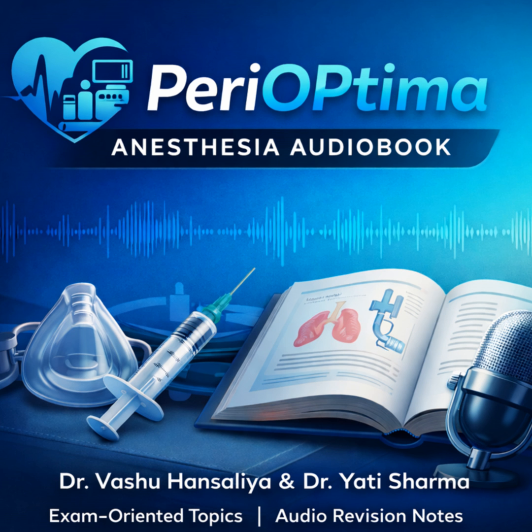You must be able to distinguish these clearly. It's the first question they'll ask. Veno-arterial, or VA ECMO, drains blood from a vein and returns it to an artery. And because it returns to the arterial system, it bypasses the heart and lungs. Therefore, VA ECMO supports heart and lungs.